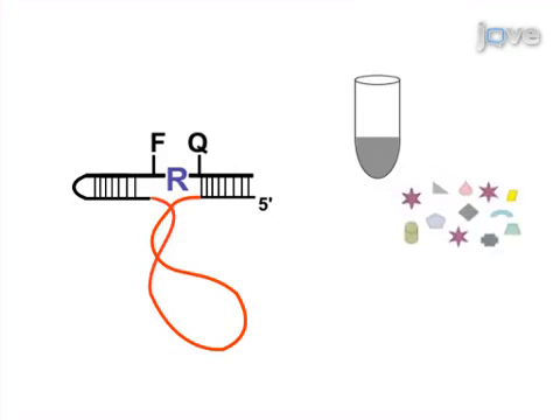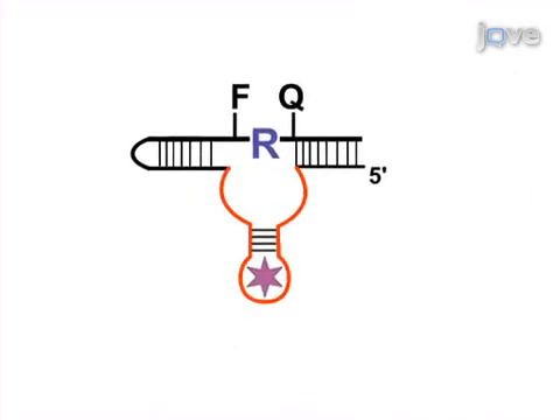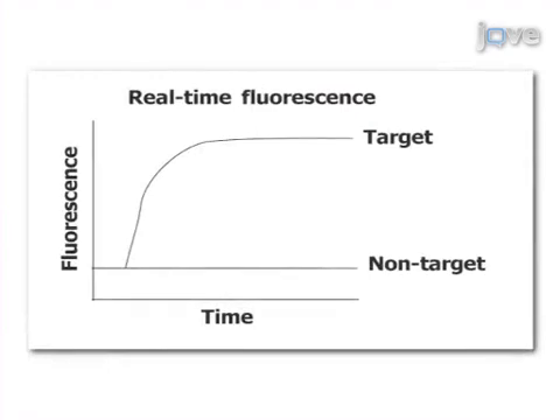The crude extracellular mixture is then combined with the DNA-zyme probe. Interaction between the DNA-zyme probe and target molecules results in cleavage of the probe, which then fluoresces. Using a fluorometer, interaction between the probe and target is seen as an increase in relative fluorescence.